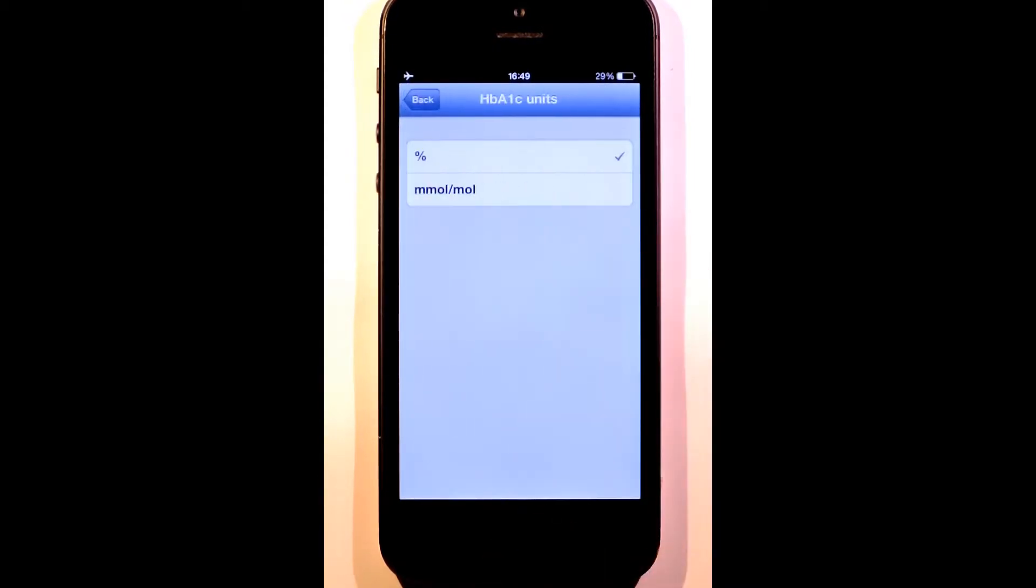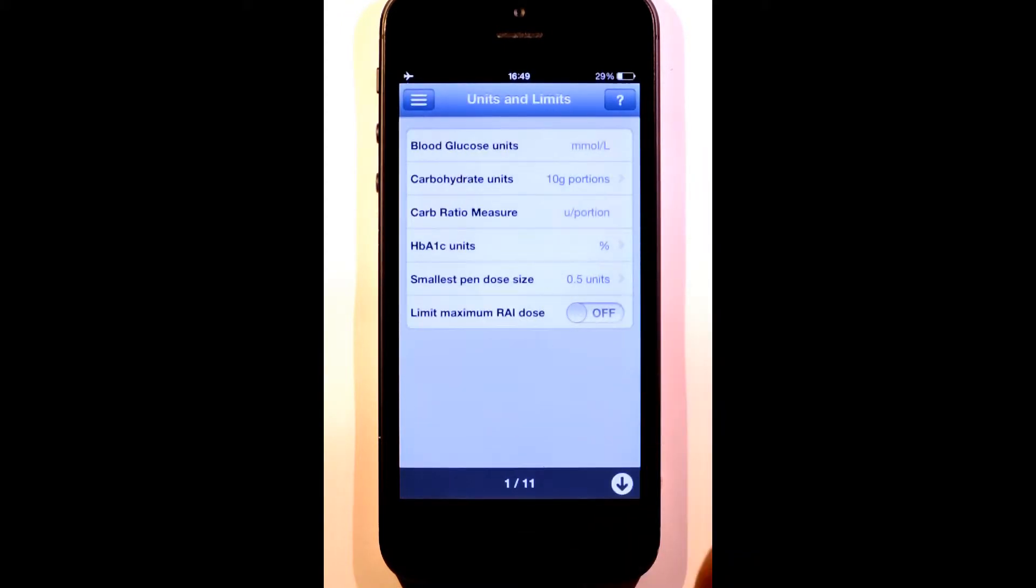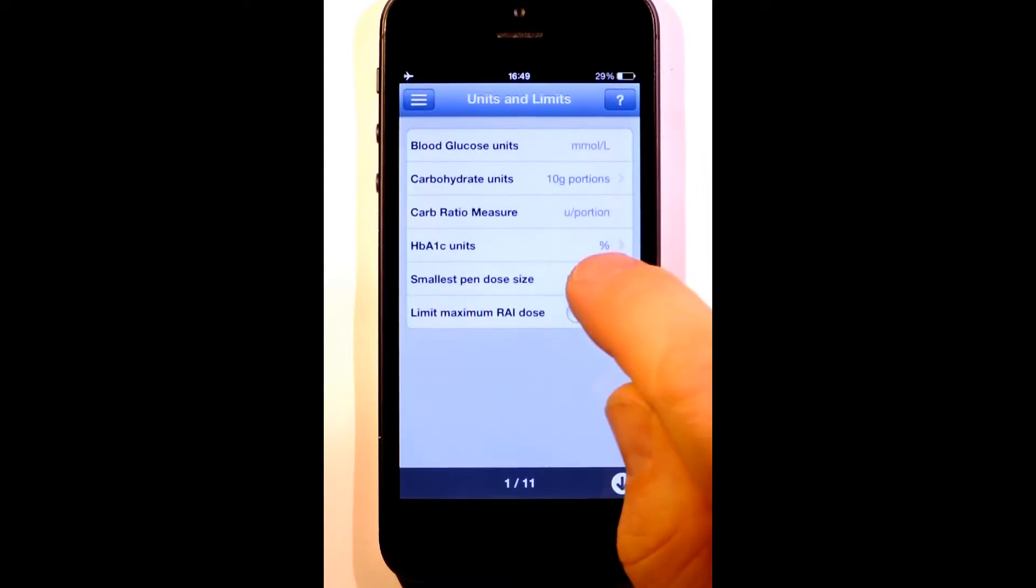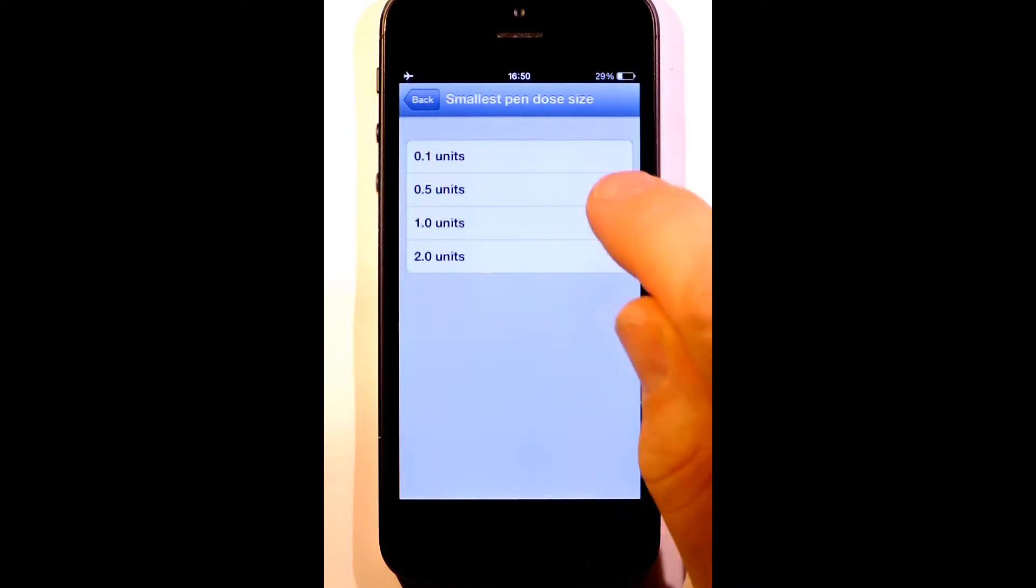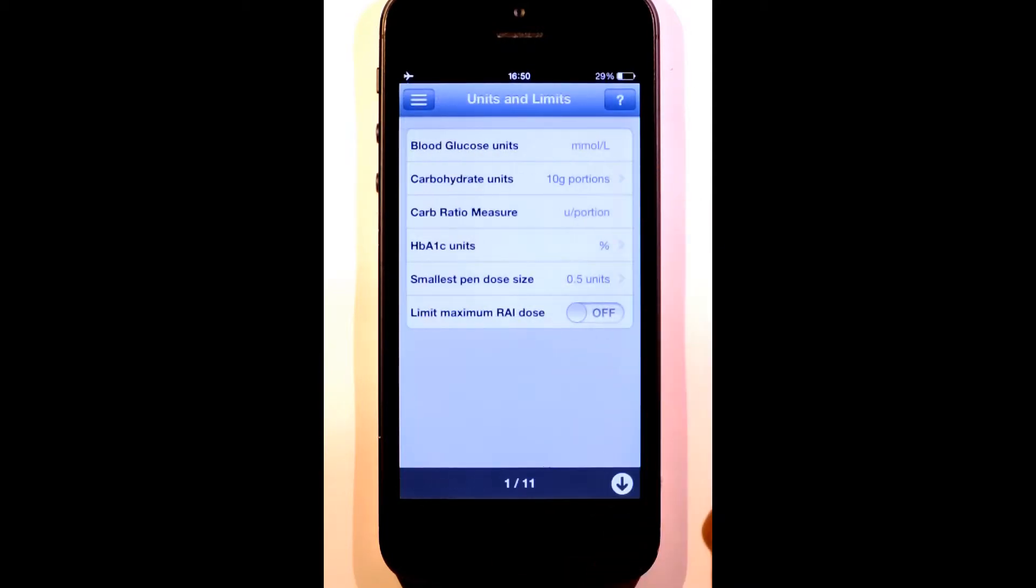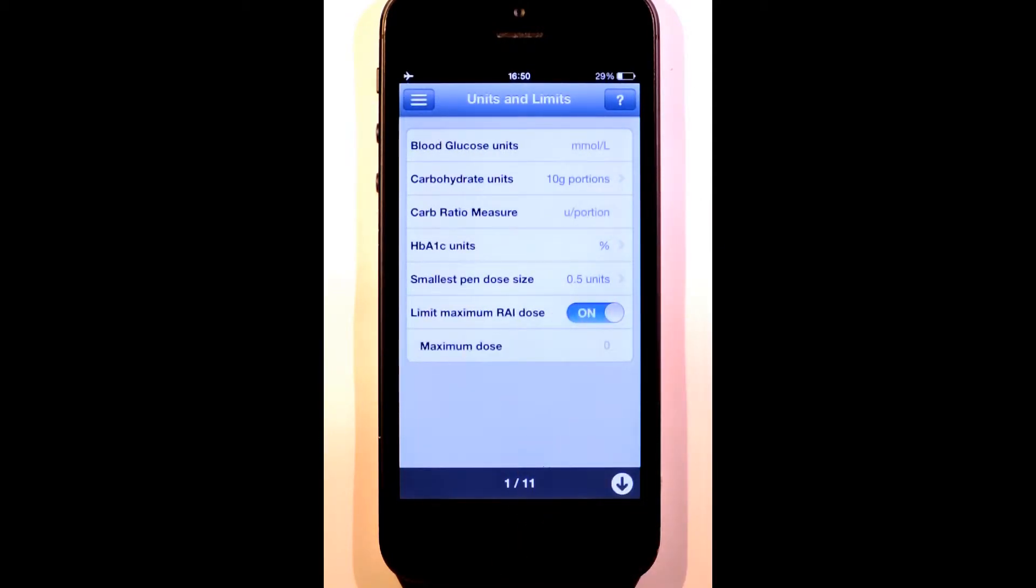I can choose to have my HbA1c expressed as either a percentage or in millimoles per mole. Here we set the smallest dose that you can inject with your pen or syringe so that RapidCalc can round its suggested dose to match. The last option is a safety feature, especially for children, to limit the maximum dose that RapidCalc will ever suggest.